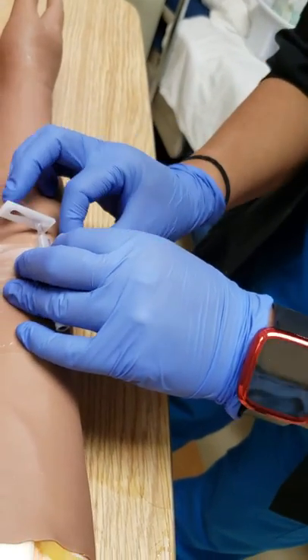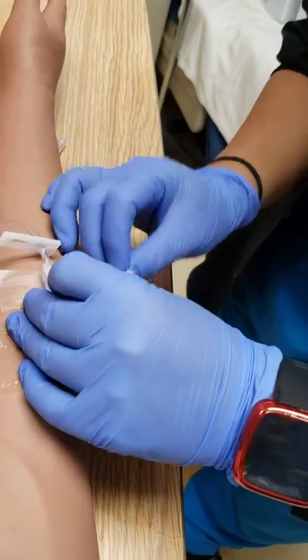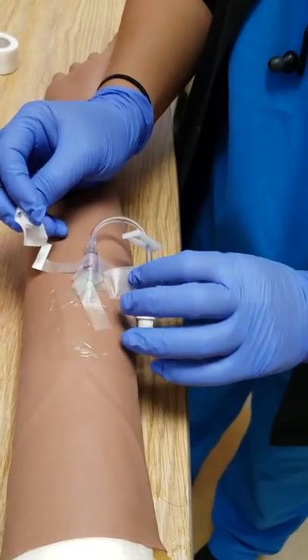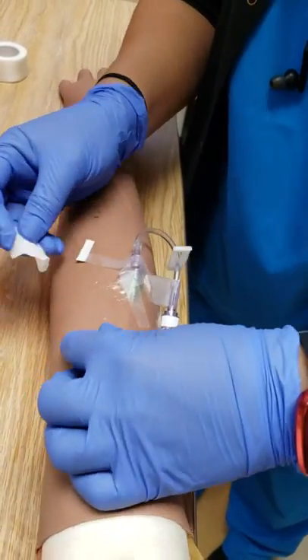If the IV has been on the patient's arm for a while it may have become really sticky, so these things can be hard to remove. We're going to peel the dressing and the tape all around the insertion site.